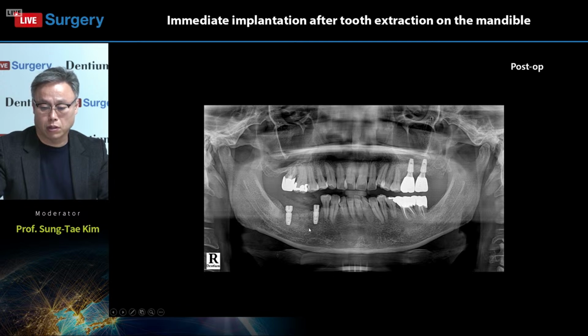placed well, and didn't damage the mental foramen in this area. And the tooth axis looks like this, 47 mesially angulated, and 45 distally angulated. The implant was placed parallel to the adjacent number 44, and perpendicular to the occlusal plane. And you cannot see the buccolingual relationship, and it is perfectly aiming at the inner incline of the functional cusp of the opposing dentition. And it's a beautiful case.